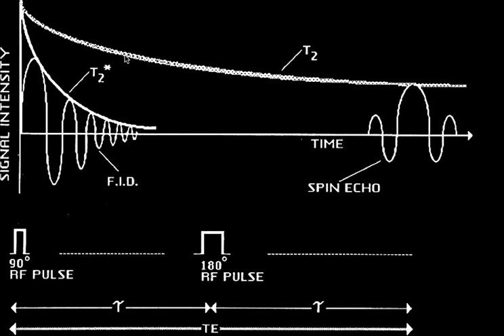The other difference, between the T2 curve and the T2 star curve, is the phase variations due to fixed magnetic fields that don't change. But we know if they're fixed magnetic fields and don't change, then when we do the echo, we'll get all that signal back. So the signal from the baseline to the top of our echo is all spins phasing that's due to the fixed magnetic fields. All this that's lost above due to T2 is due to the time varying magnetic fields.